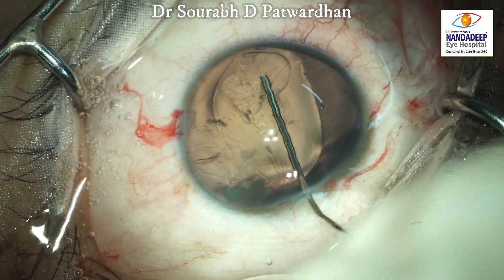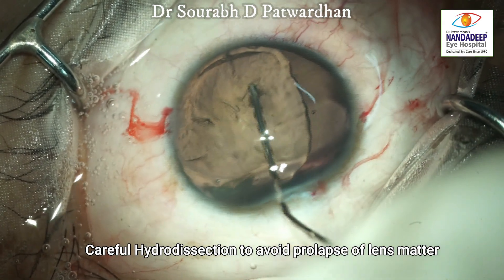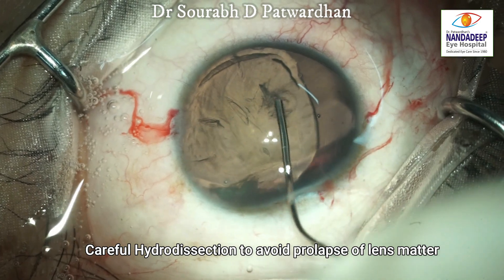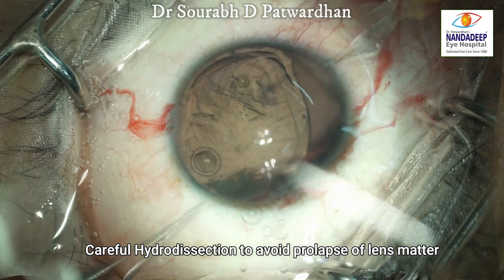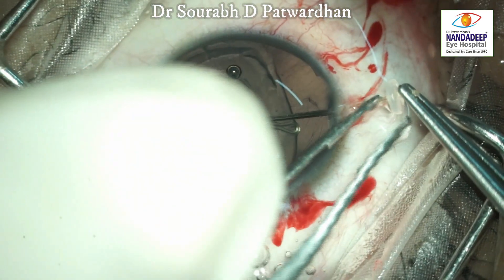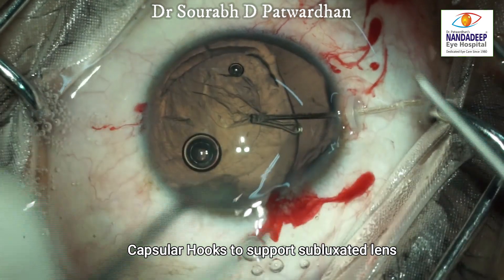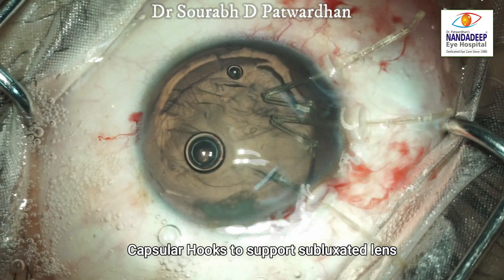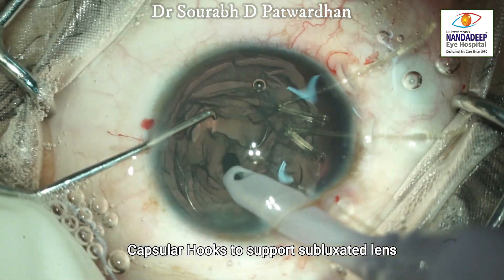The hydrodissection has to be very careful and gentle — try to do cortex-cleaving hydrodissection, but at the same time see to it that the nucleus does not prolapse out. Now we have to insert the capsular hooks. These are MST capsular hooks. You can see they are long, they have an atraumatic curved tip at the end, and they support the bag very well.